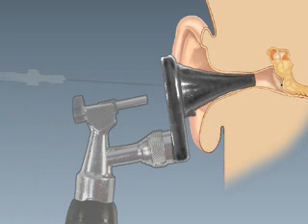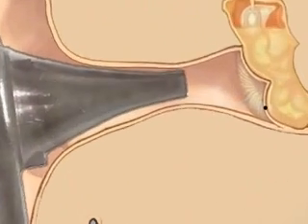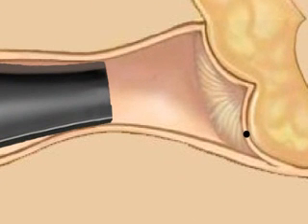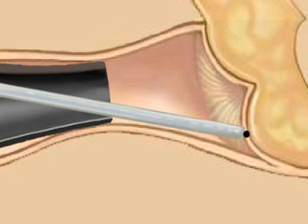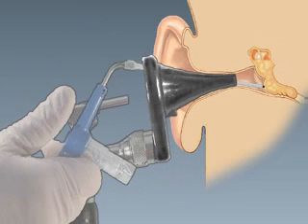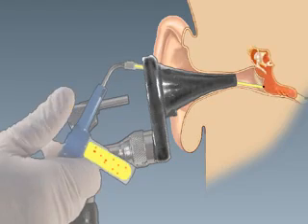Use a second tympanocentesis aspirator with a flexible catheter to suction any remaining pus from the middle ear. Insert the catheter through the speculum and place it over the opening in the tympanic membrane made by the needle. The catheter should not go through the tympanic membrane. This step also clears the debris in the external auditory canal and may enhance visualization of the tympanic membrane at future visits.